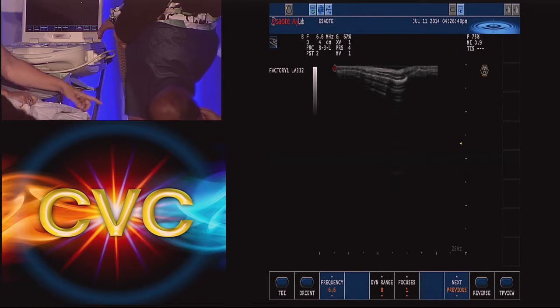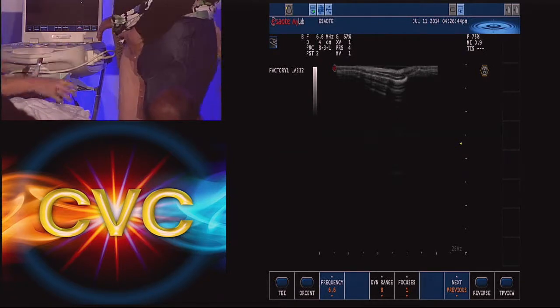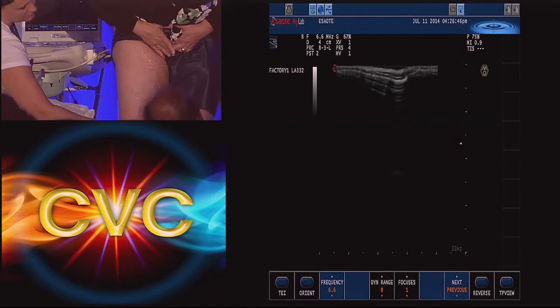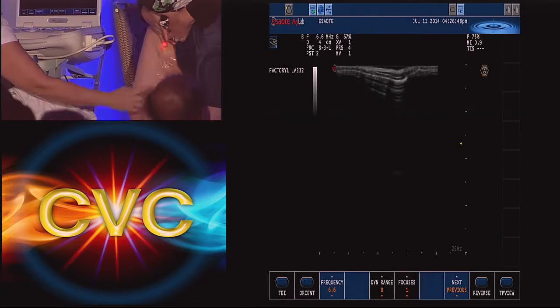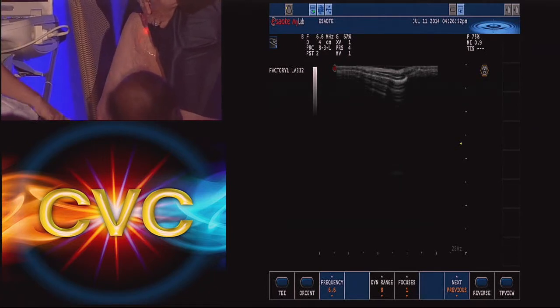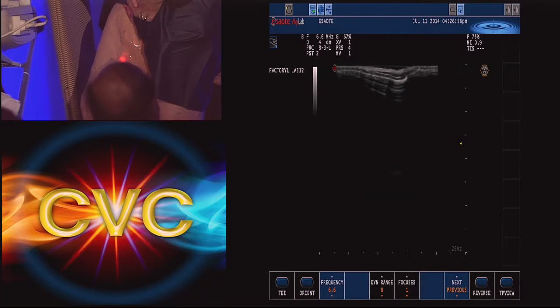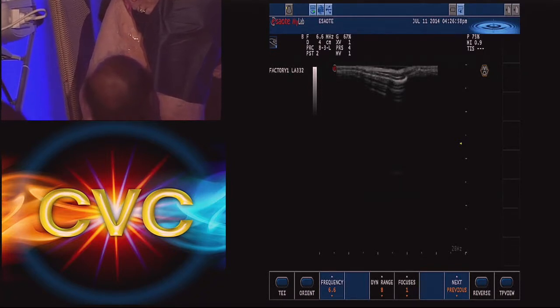Is there a way for us to just look at it? Can you turn around? Okay, so if you look at her leg for one second, we see a big branch, anterolateral, coming out, going down. Her incompetence could just be from here to here. It doesn't have to be the whole saphenous. And the pressure is reflecting from there, going down.